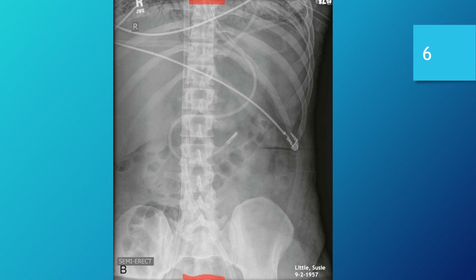As we know, the inferior most portion of the bladder must be present on the image, and that's identifiable by the presence of the pubic symphysis in the image. And this one is not. If anything, we have about perhaps half of the upper portion of the patient's pelvis present in this image.